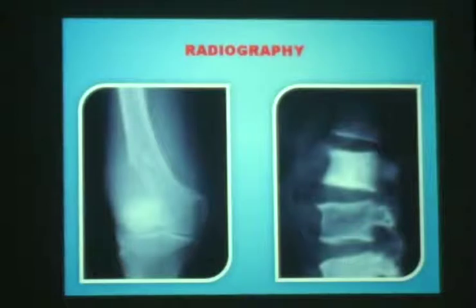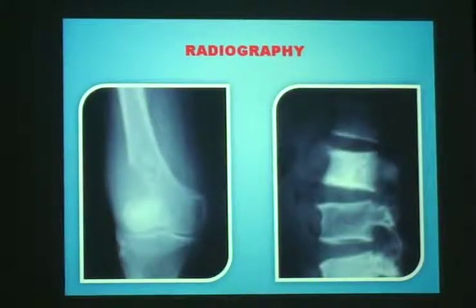Now, imaging in bone metastasis. As for radiography, it is known that there has to be a certain level of altered mineralization or demineralization for the lesion to appear. As we can see here, there is an osteolytic lesion. It is a sizable lesion, and there is also diffuse sclerosis of this lumbar vertebra. But then if we are talking about subtle marrow lesions, definitely they would be missed on radiography.